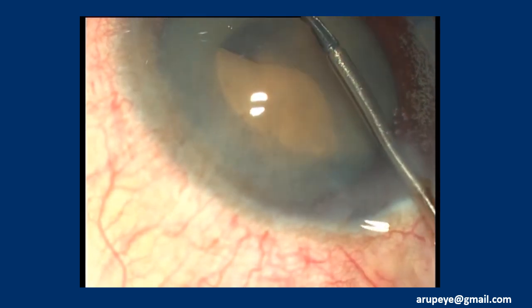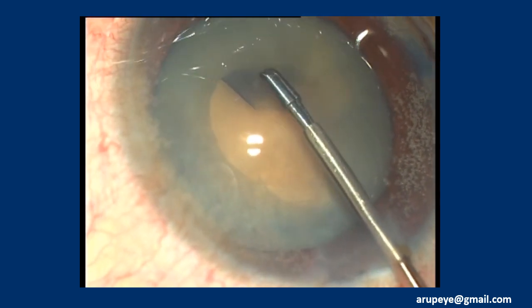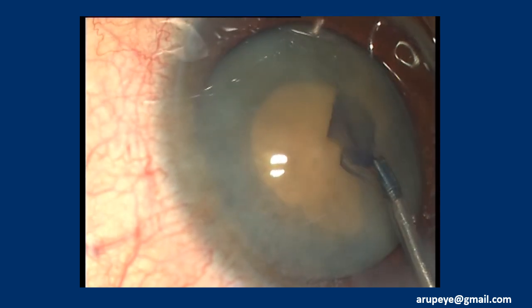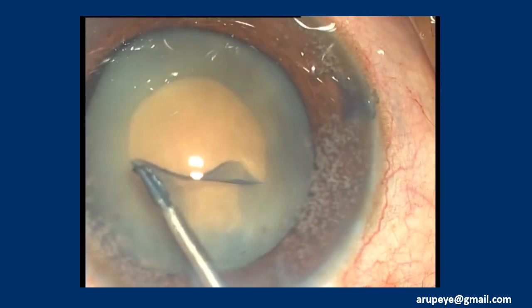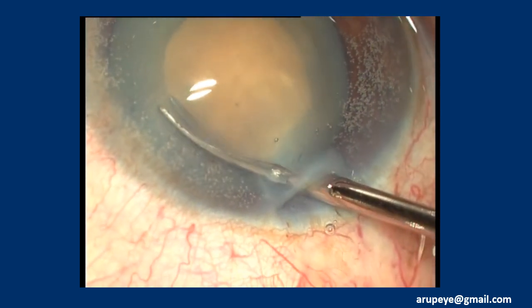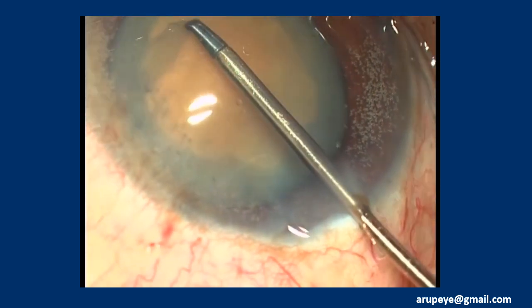As mentioned earlier, rhexis extension at this stage is not to be expected, and it will be an iatrogenic problem if at all it happens. Once the rhexis is carefully obtained, the phacoemulsification generally progresses quite smoothly. The rhexis is not quite round here, so I again incise the margin of the rhexis to make it a good circle — a good geometrical shape for performing a safe phacoemulsification.